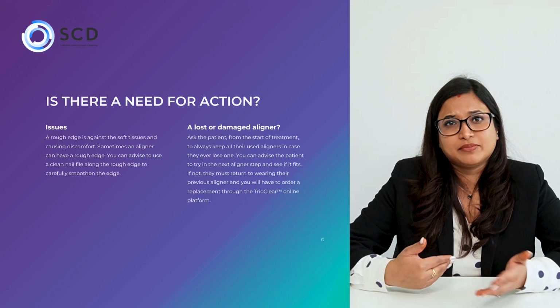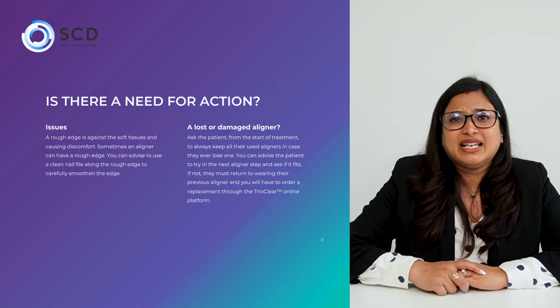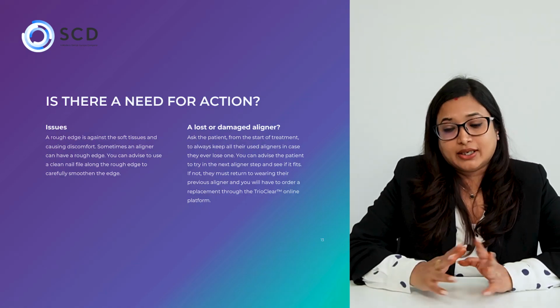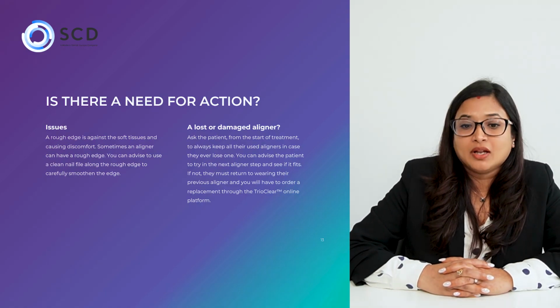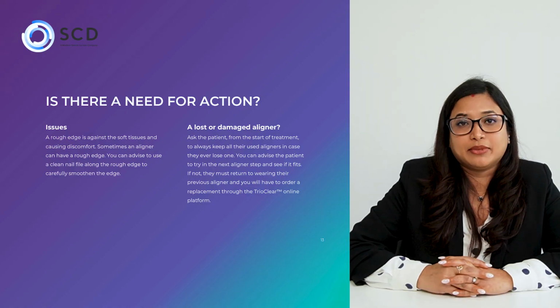So it's good to have something given to the patient where it is written to save your aligners till your treatment is completed. Because many a times you have to backtrack, you have to use the previous aligners, and in such situations it would be useful if they have all the aligners properly kept. You can advise the patient to try in the next aligner step and see if it fits. If not, they must return to wearing their previous aligner, and you will have to order a replacement aligner through the TrioClear online platform.